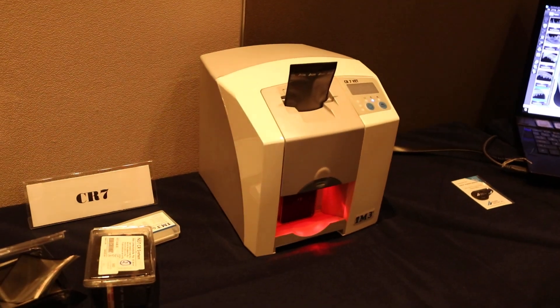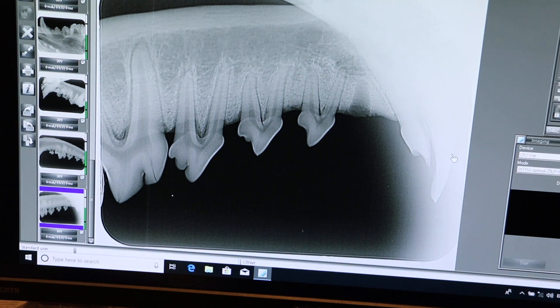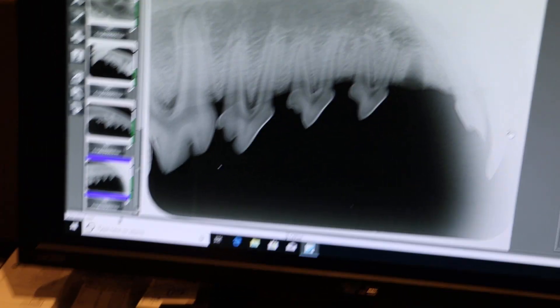That's just why they're here. Instead of it going into a straight — because if it went into a straight... So it's finished. What's happening is when the x-rays... Beautiful. Okay.